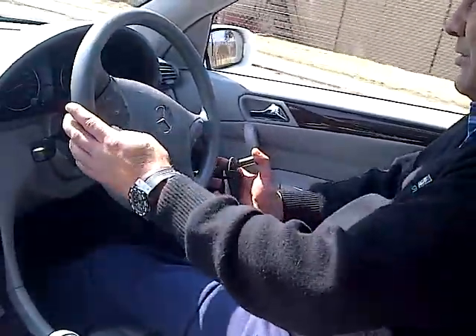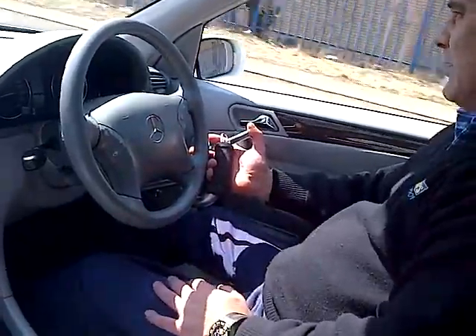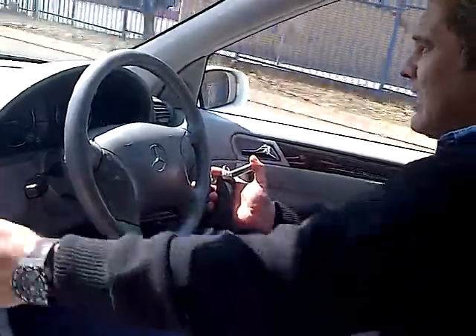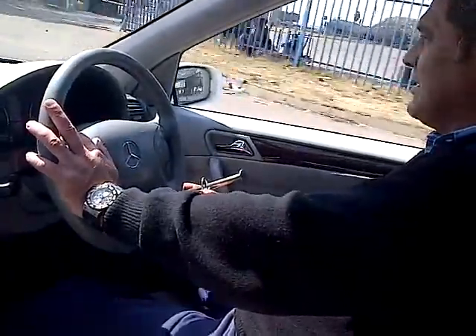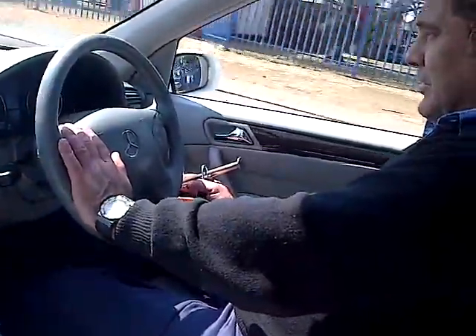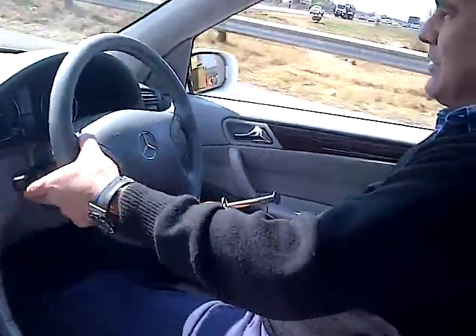One nice thing is it's one of the only controls where you can actually use your right hand while having the hand controls in your hand and holding the steering wheel as well. Your left hand is free to change the radio channels, put on your indicators, put on your hazard lights, or anything else you might need to do. If you need to stop, simply press down the brake and switch on your indicator.